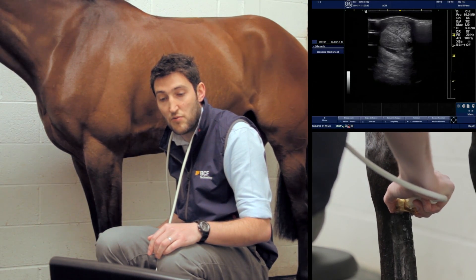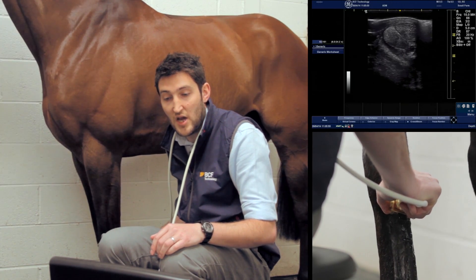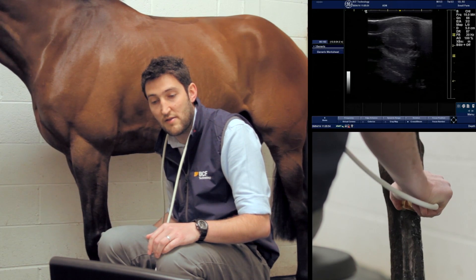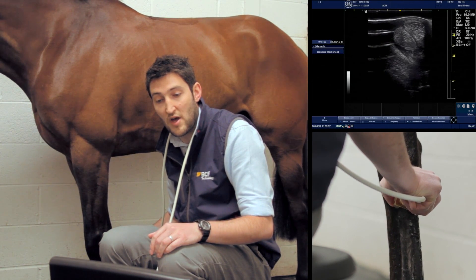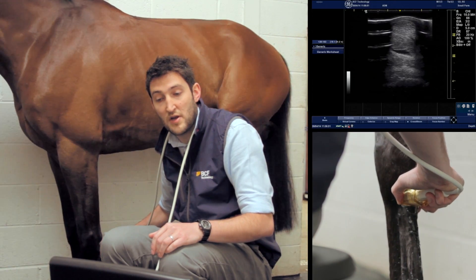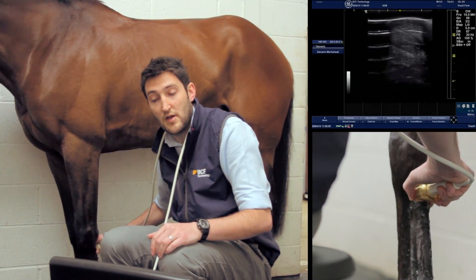Moving the probe slightly laterally, we can see that this brings in the lateral border of the deep digital flexor tendon. This allows us to check that all is well along that edge, and this is the shot we would use if taking cross-sectional area measurements later on.